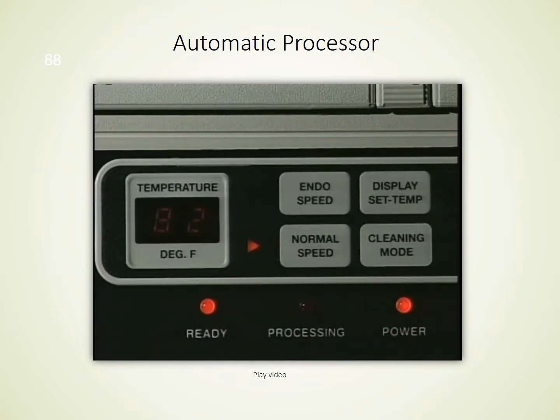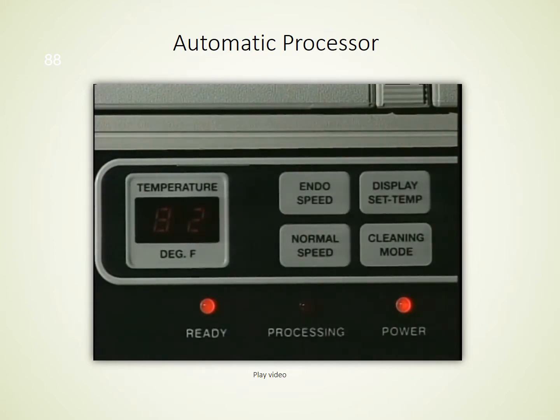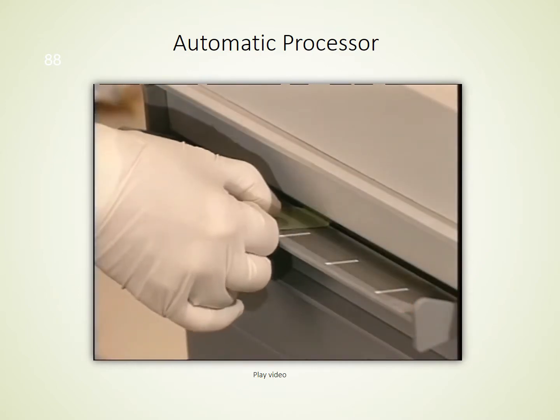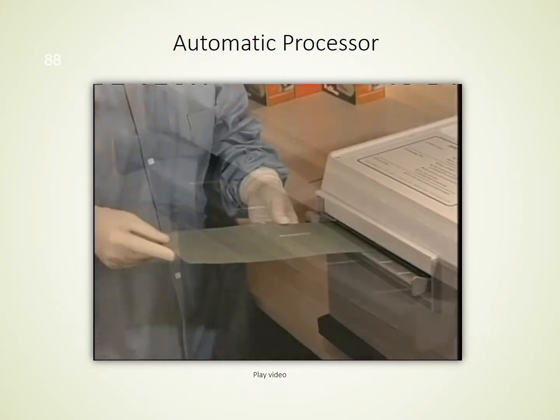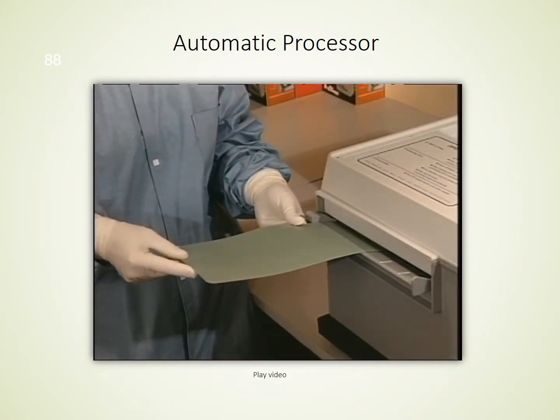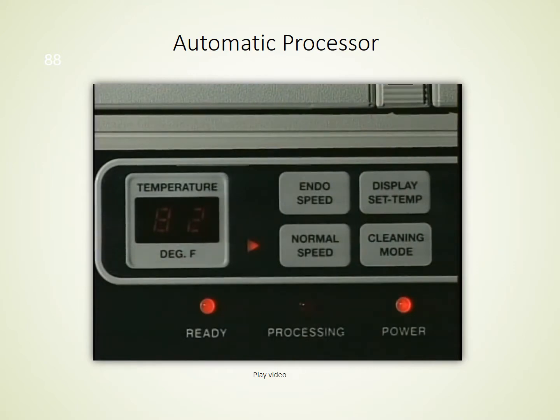That's when the processing light is off. When activated, the endo speed indicator light flashes as a reminder that the processor is set to this speed. Please note that only one number 2 film can be processed at a time while in this mode. When a film is inserted, processing starts automatically. Wait until the processing light stops flashing before inserting the next film.